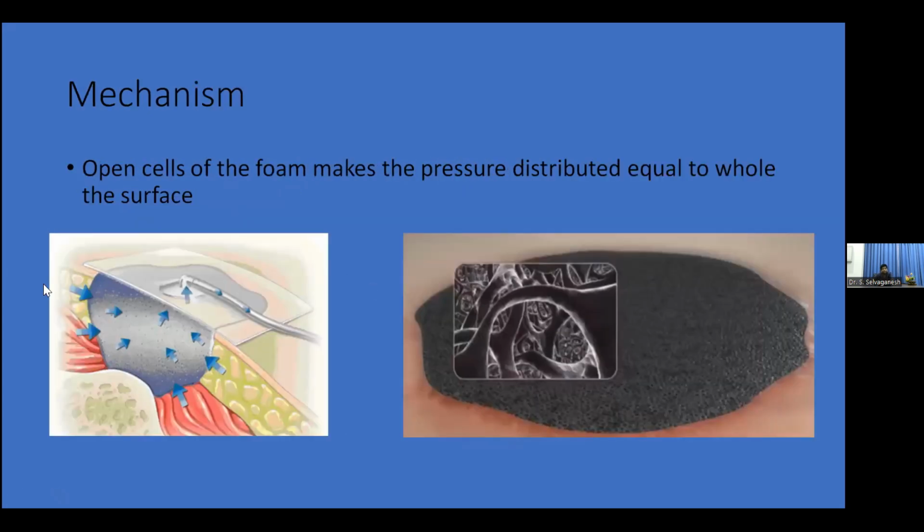So when the wound surface is applied with foam, the beauty of this foam is that when you apply the negative pressure, it won't get compressed. The micropores are maintained, so the pressure is applied equally over all the surface areas.